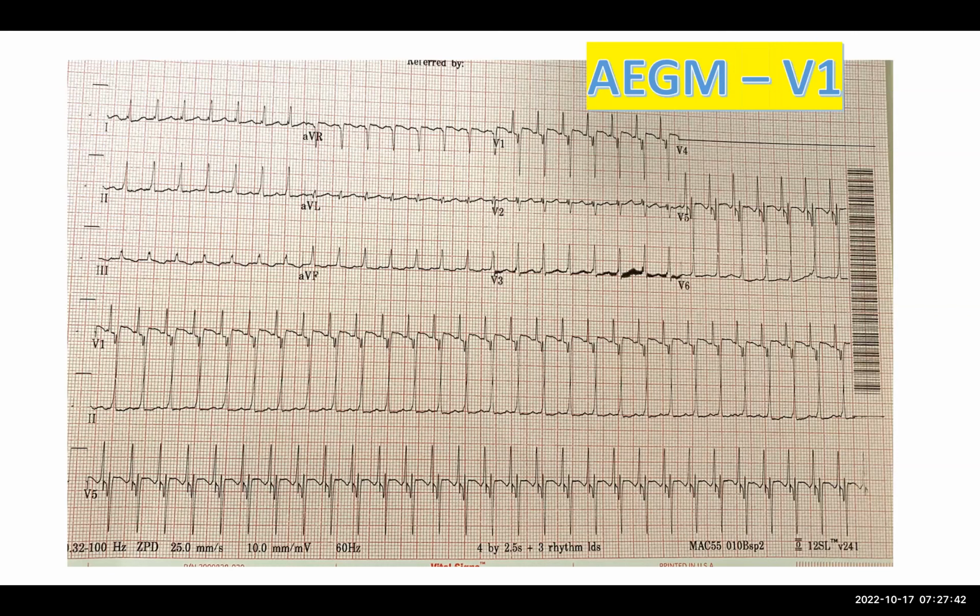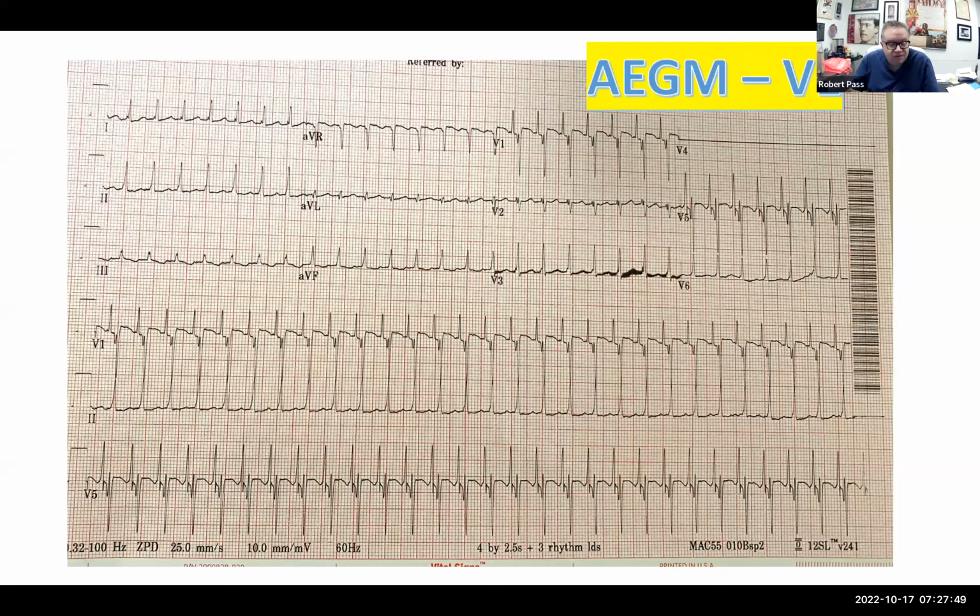So I would think PJRT, EAT, or atypical AVNRT for a very long RP. That's very good. So again, EAT, PJRT, or atypical AVNRT. Atypical because in typical AVNRT, the RP interval would normally be short, meaning less than 70 milliseconds. So yes, those are all possibilities. Any other additional ones in this patient?